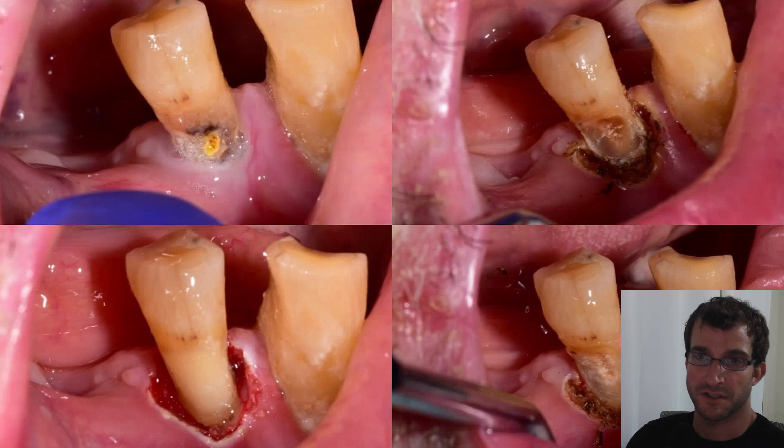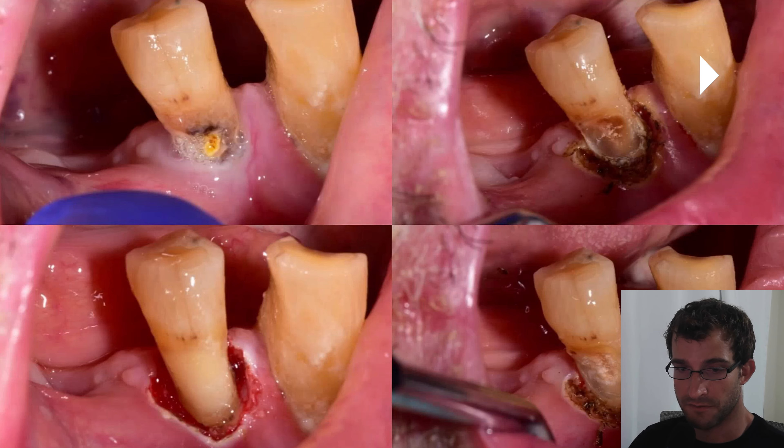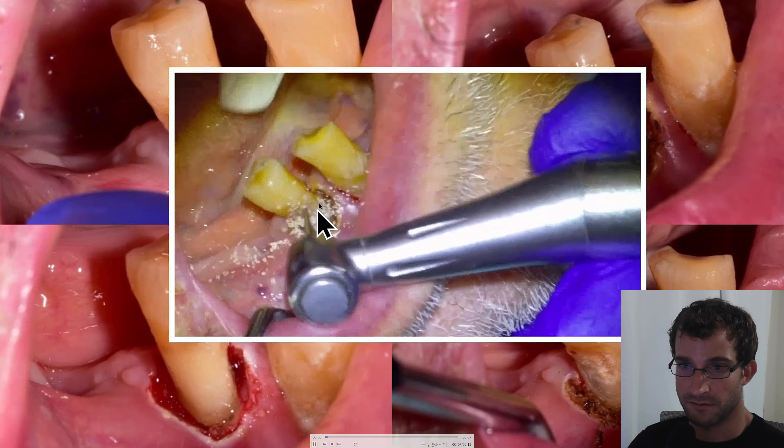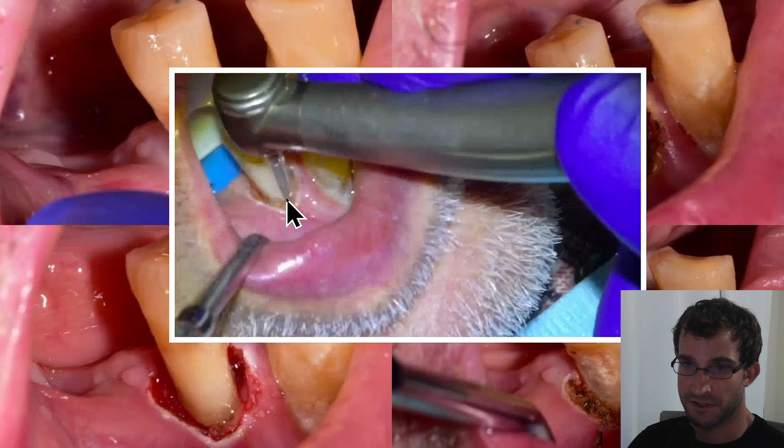Hey guys, Dr. Dobson. We're just going to be doing a filling in this video. This is a tooth 44 — this patient had a cavity in the tooth that went pretty well under the gums, so we're just going to be doing a gingivectomy, caries removal, and then restoring the lesion with a Fuji 2 glass ionomer. Going to do: gingivectomy, caries removal, etch, bond the material.